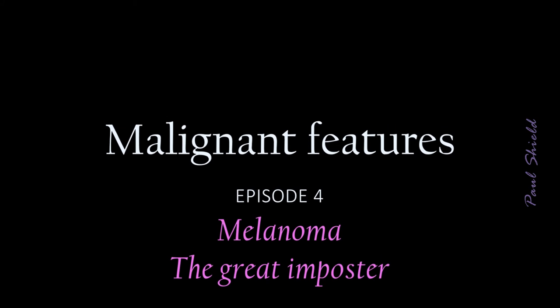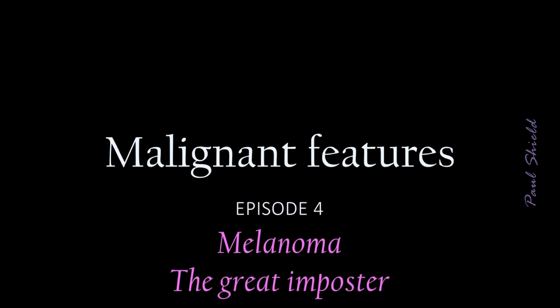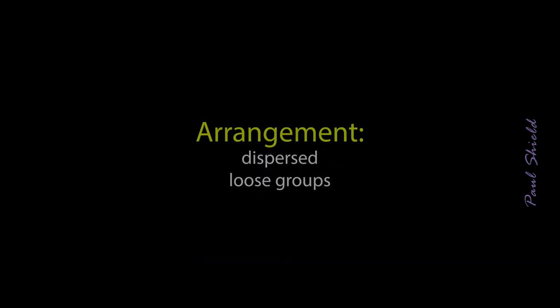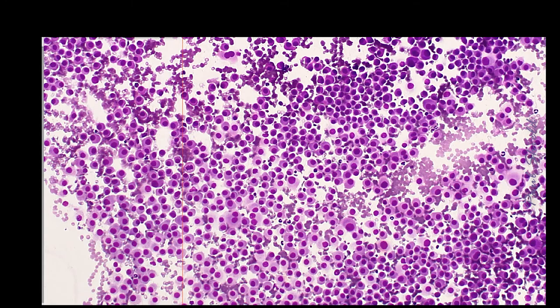This episode we'll look at melanoma. It's known as a great mimic of other types of malignancies and can cause quite a lot of differential diagnostic problems because of that. All of the cases I'm going to show you are from lymph node, but melanoma can present in almost any cytology specimen, and the features I'll talk about are generalizable to those as well. As usual, we'll look at arrangement, cytoplasmic and nuclear features and how they're expressed.